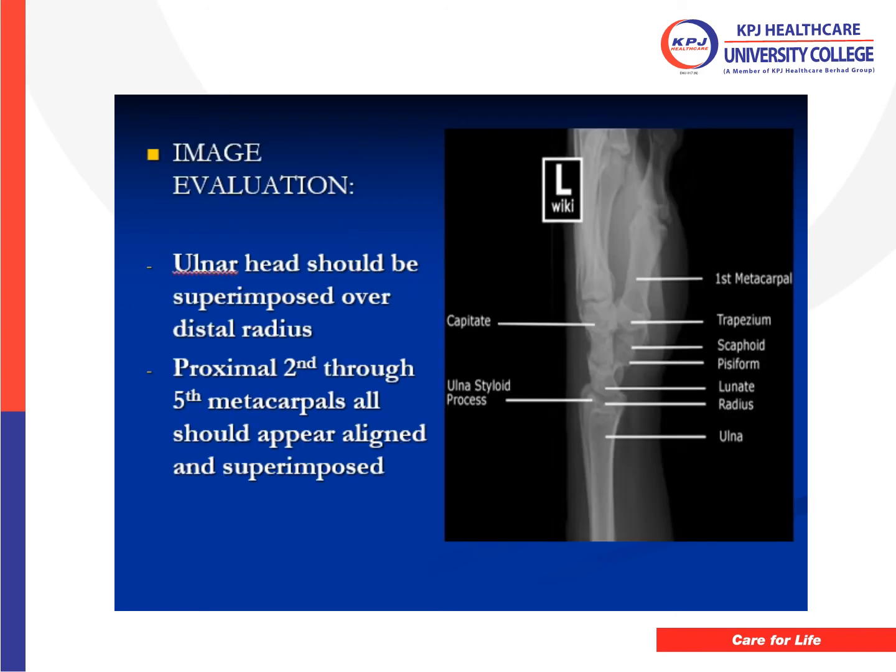Okay, this is the image to be seen in the radiograph. Okay, make sure the marker is not on the side of the anatomy here. It's supposed to be a bit outside. Okay, what I mentioned, you have to include it, and you have to make sure it is superimposed.